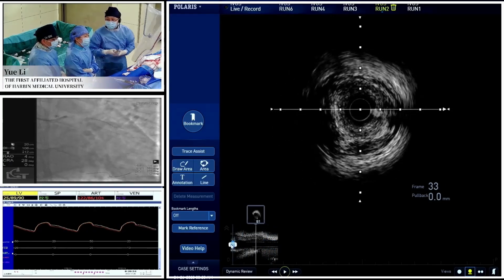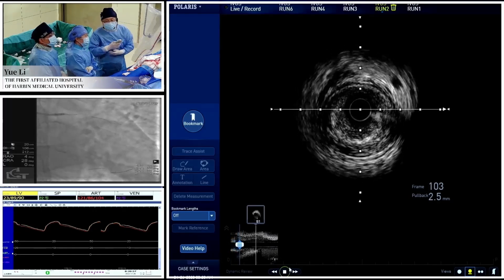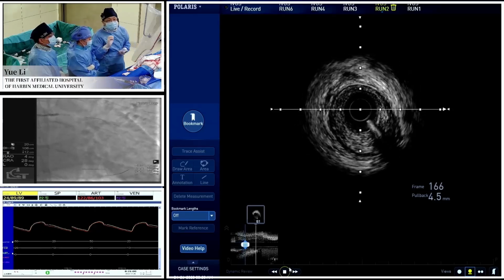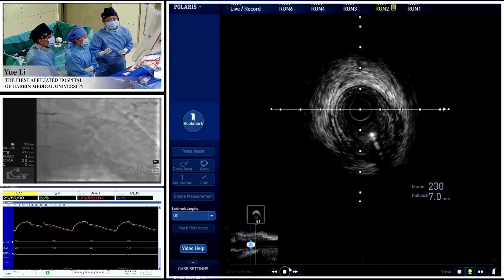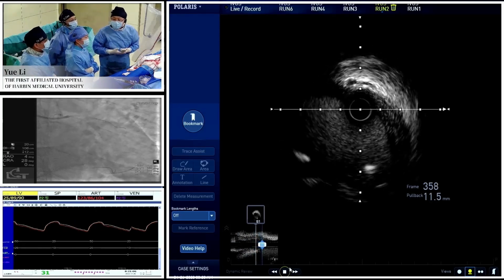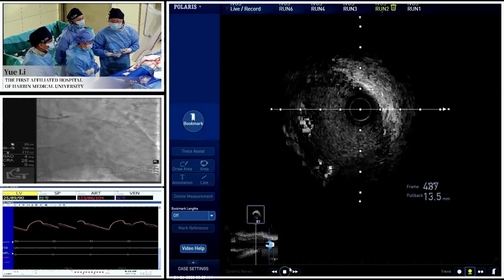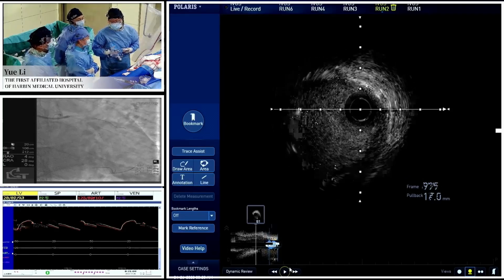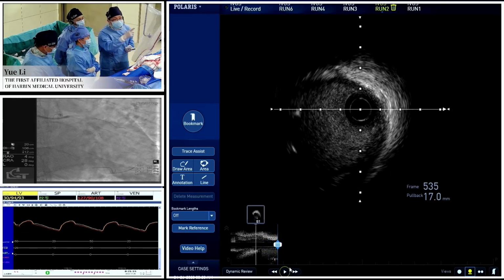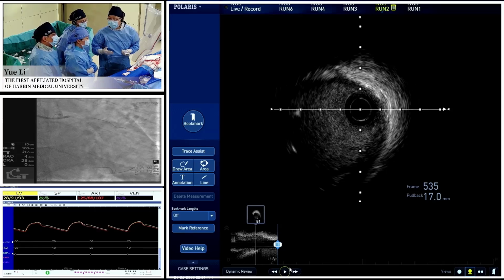Just like we talked just now, because the IVUS catheter couldn't be advanced to the optimal place, from the first run we couldn't see the ostium of the proximal LAD. But one thing we can make sure, in the proximal portion, there is no proximal fibrotic cap.